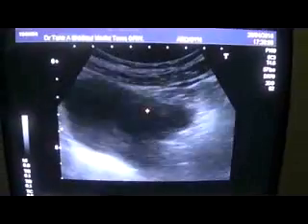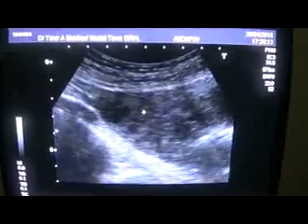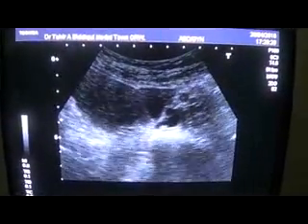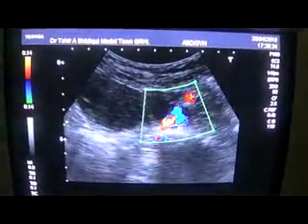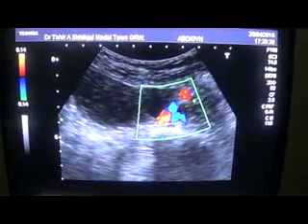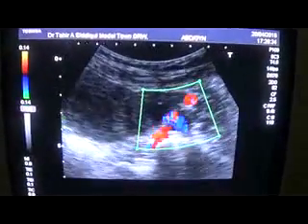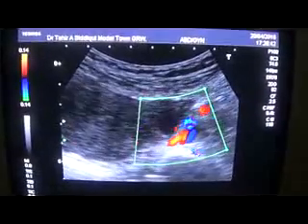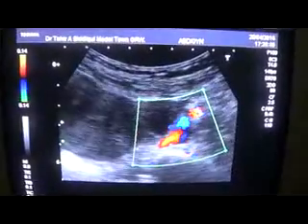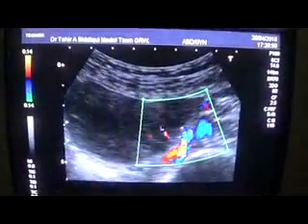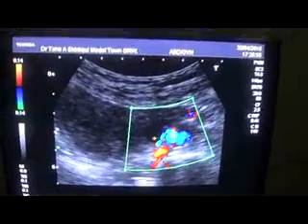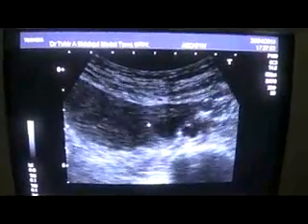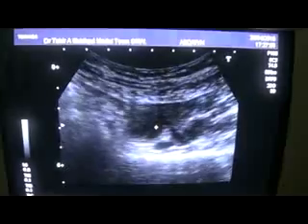Now this is the region of the left ovary — this is the left ovary. You can see the left iliac vessels; these are the left iliac vessels. And you see there is a small sac or cystic area. Keep an eye on this cystic area. I am going to give a sweep to the probe — keep an eye at this region and you will see if it changes its shape or retains its shape.